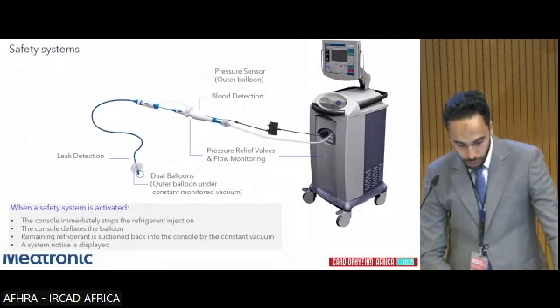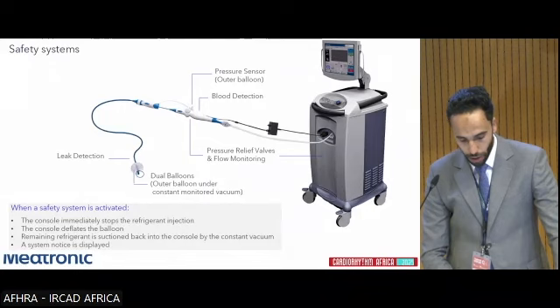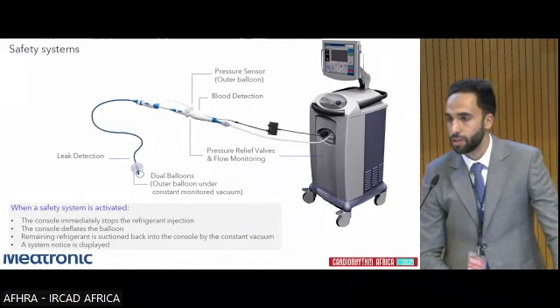We have a pressure sensor at the outer balloon, a blood detection sensor, a pressure relief valve, and flow monitoring. All of these sensors are a safety system to save the patient from any harm.